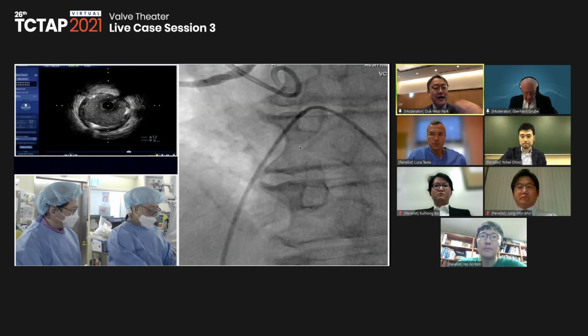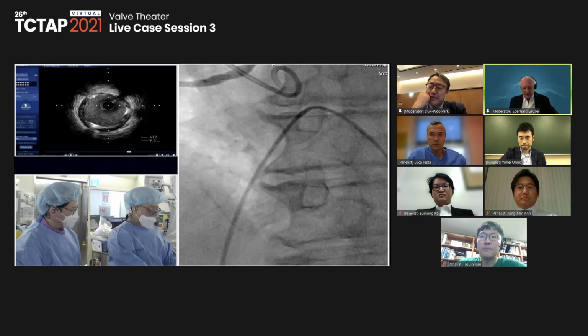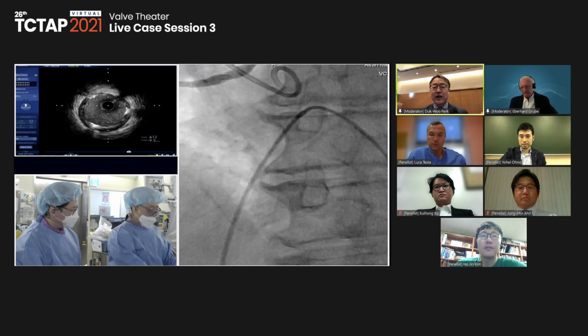Yes, I think that is a very good point, Yohei, and certainly worth discussing. Sometimes before surgery the patient shows a very tight lesion, and we check the FFR of the right coronary. This patient had a reduced FFR, so we decided the primary purpose was the reduction of perioperative risk, and we put in a BioFreedom stent. The BioFreedom is usually used for preoperative patients, and 1 month later we can do major surgery. So in this patient, we put in the BioFreedom and then did a simultaneous TAVR.